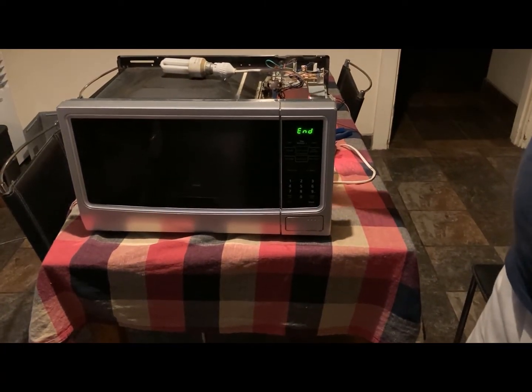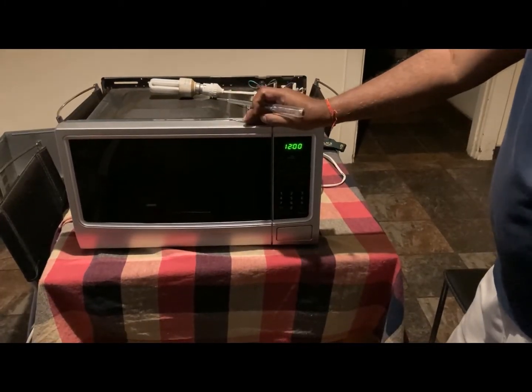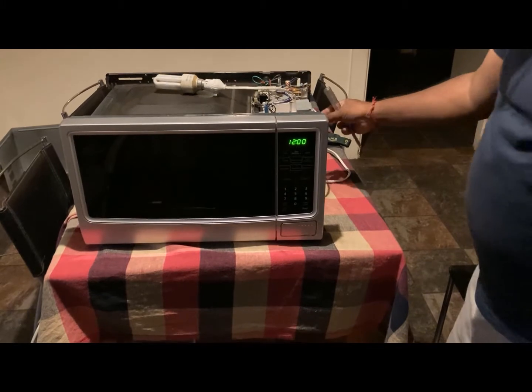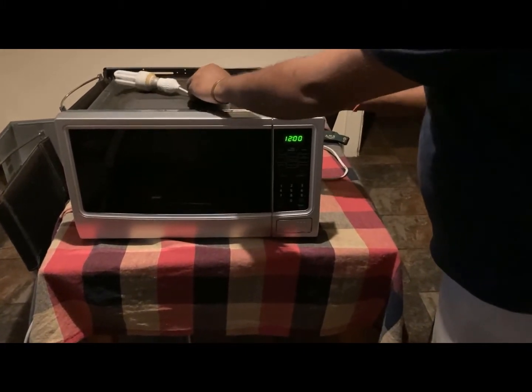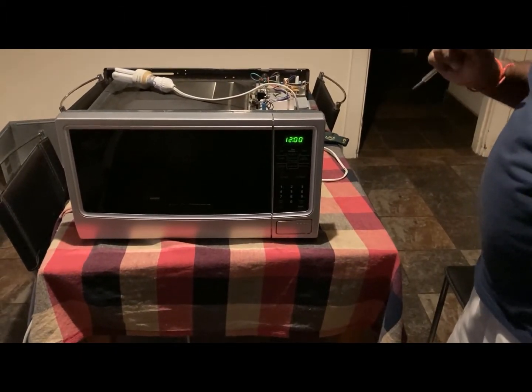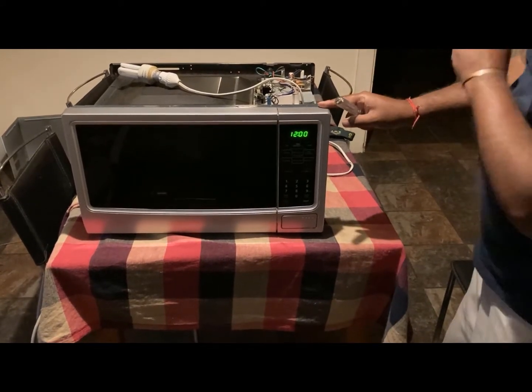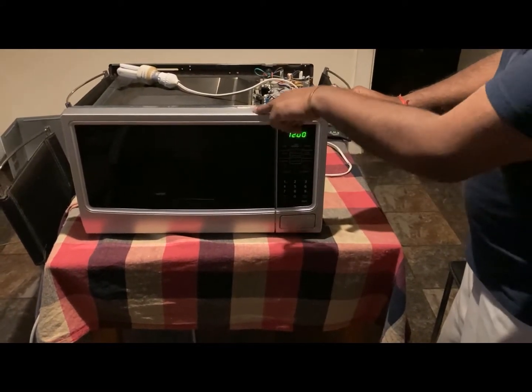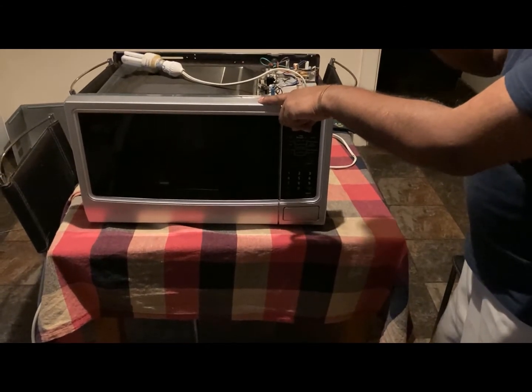So your globe is out. On second thought, I think I will leave that fan on. Why? Because if there are any children or whoever is in, they will hear the sound that this is on. But let's do another demonstration. This time I'm going to leave the fan on, but when I open the door, that globe needs to be switched off on its own.